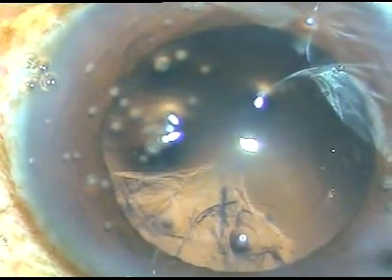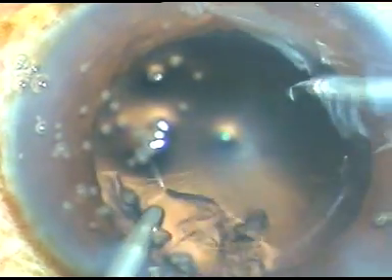Irrigation is from the right side port and aspiration is from the left side port. Now I change hands — irrigation is now from the left side port and the aspirating probe is from the right side port. Now the irrigating fluid is being used to dislodge the cells sticking to the posterior capsule. In other words, I am going to polish the posterior capsule with the help of this irrigating fluid.